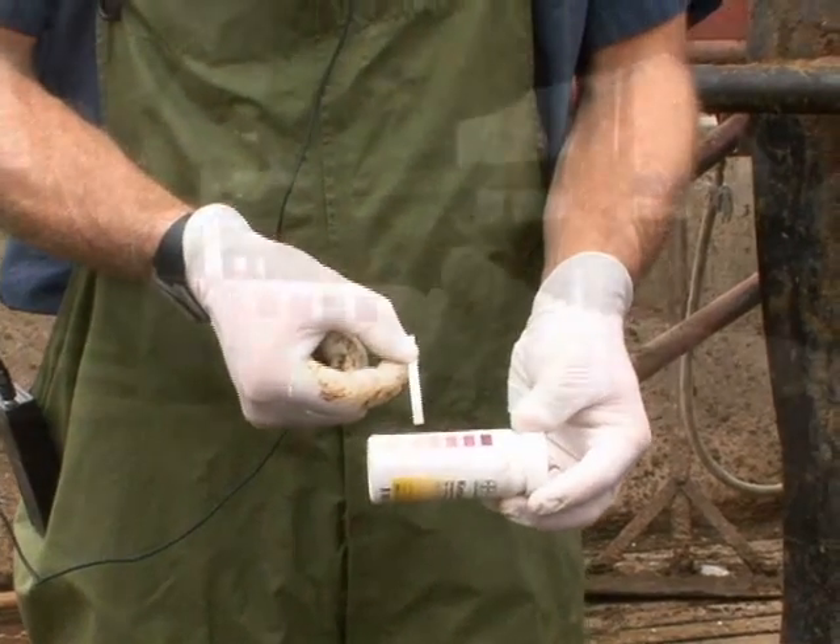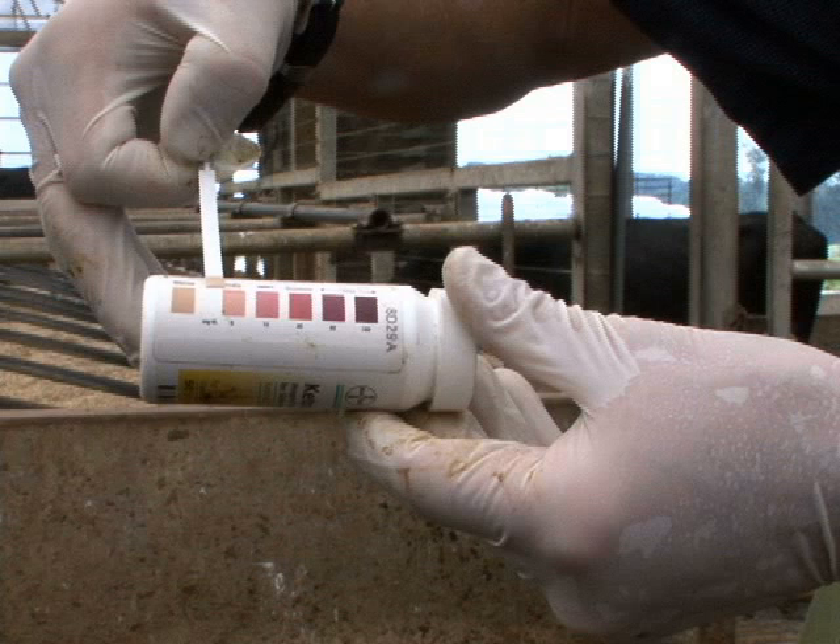For this cow, she is somewhere between a normal negative result and what we would call a trace, or light pink result, that you see on this particular keto stick. That's it.